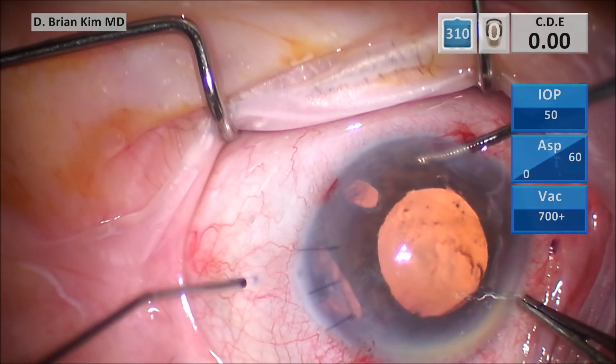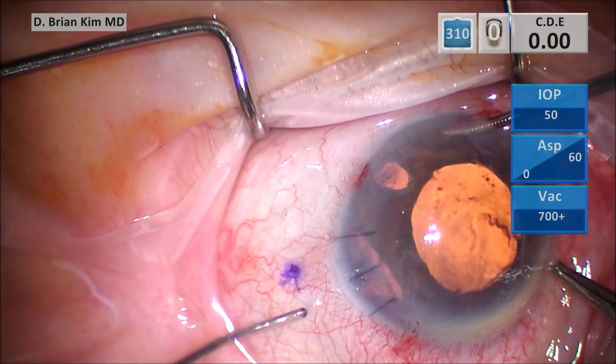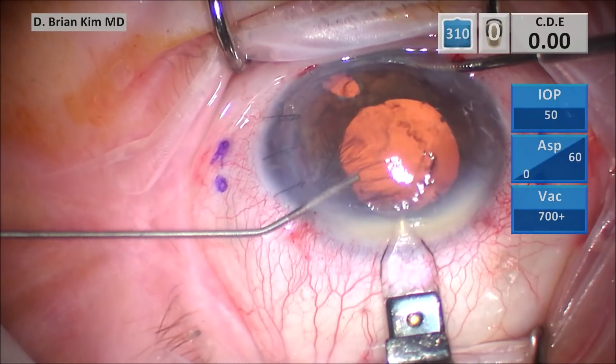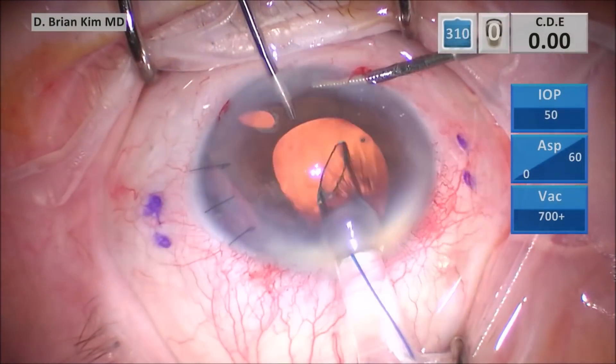I'm using calipers and then the cannula to ink 2.5 millimeters back and then two millimeters adjacent to this mark. Here I'm making my three millimeter keratome incision, which is 90 degrees away from the markings.